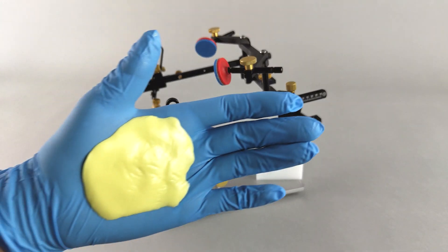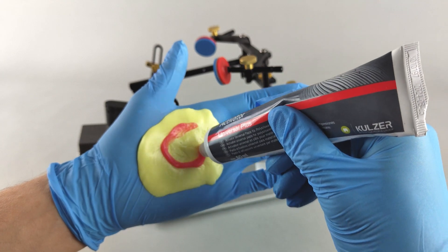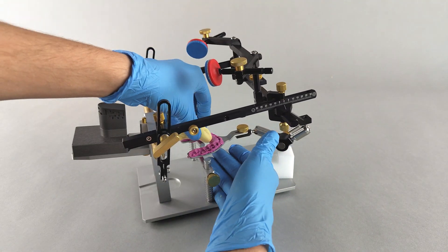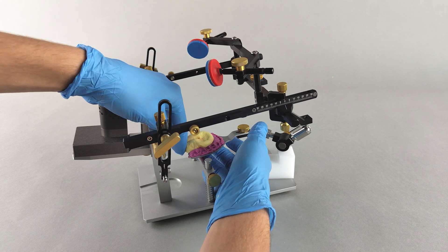First, open the transfer stand. Use an adequate, roughly palm-sized amount of putty material, add the activator and knead the material thoroughly to mix the components. Form it into an appropriate shape and place it within the dental arch of the bite fork.